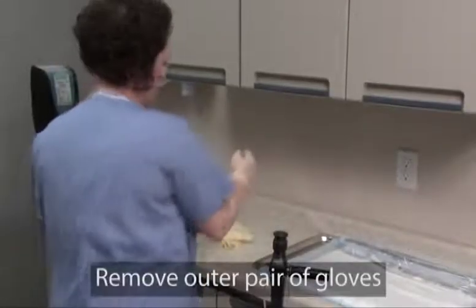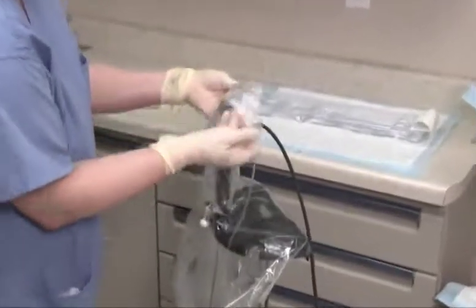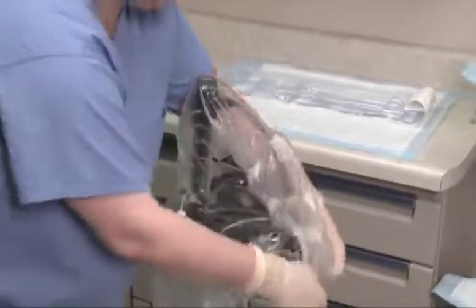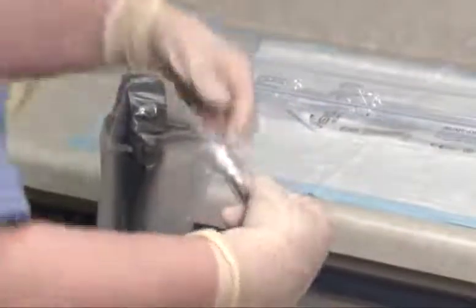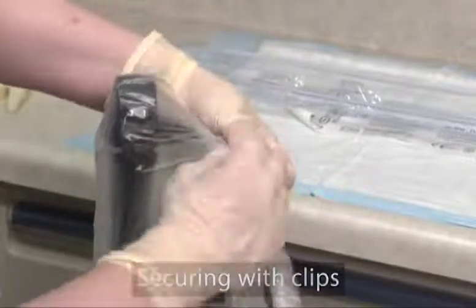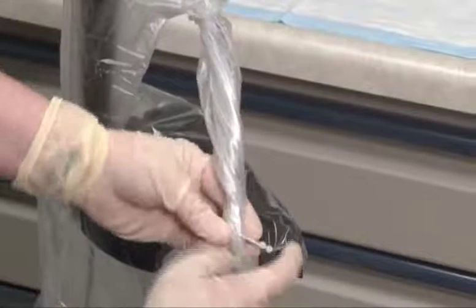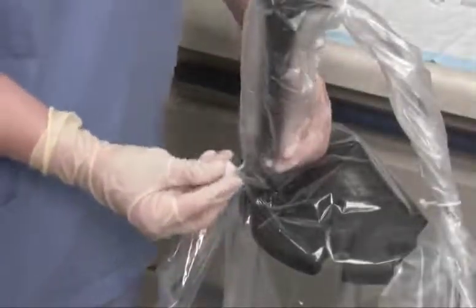Remove the outer pair of gloves. Next, pull the control body cover up and over the cystoscope control body and video scope cable so that both are completely covered. Secure the control body cover and irrigation tubing to the video scope cable by wrapping or twisting the cover around the cable and securing with the clips. Carefully place the biopsy cap onto the lure fitting until it is securely in place.